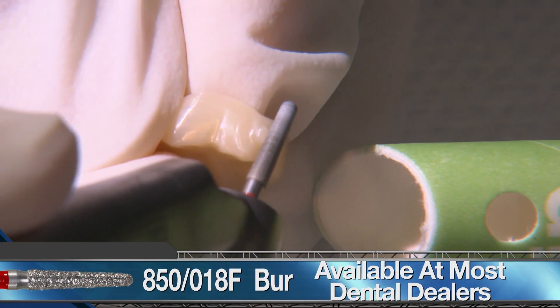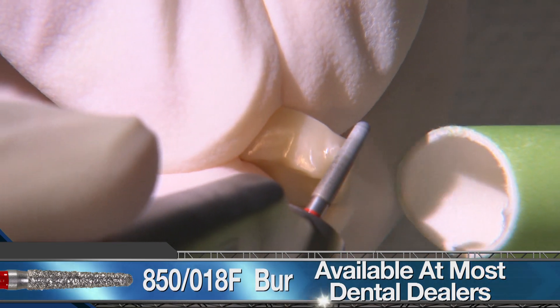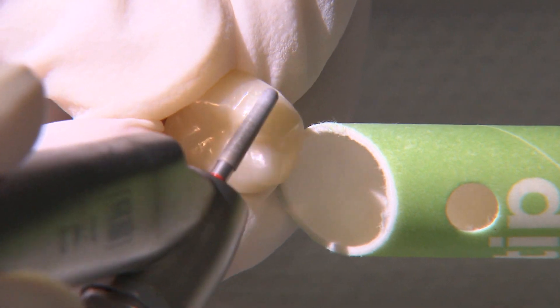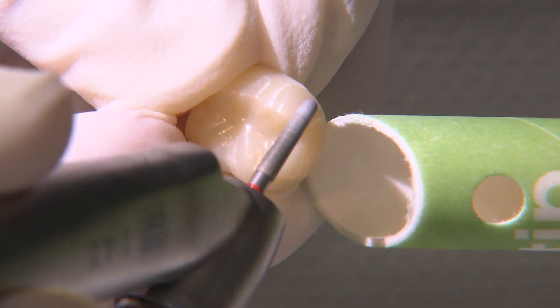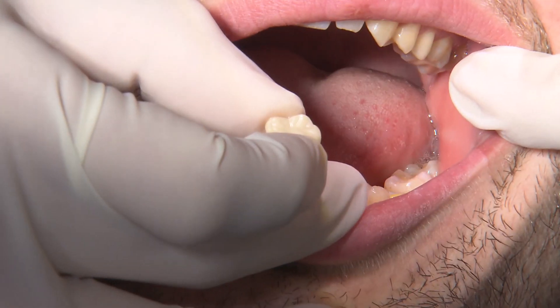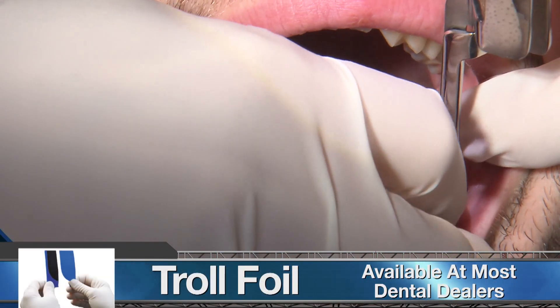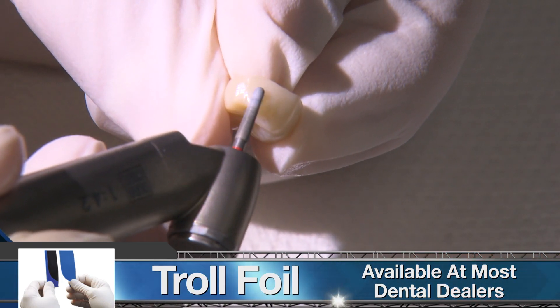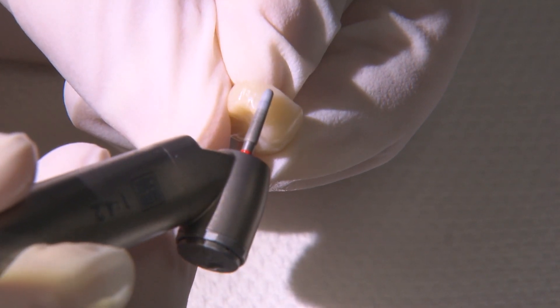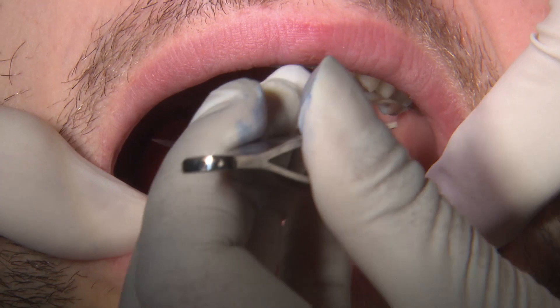I'm now using a fine grit red stripe 850 018 diamond bur to finish down the remaining sprue. With light pressure, I run the bur side to side until the crown's contour is smooth and continuous in this area. If proximal contacts are heavy, I like to position a cut piece of troll foil articulating paper between the crown and adjacent tooth to mark the contact. This way I'm not blindly adjusting the mesial and distal surfaces.